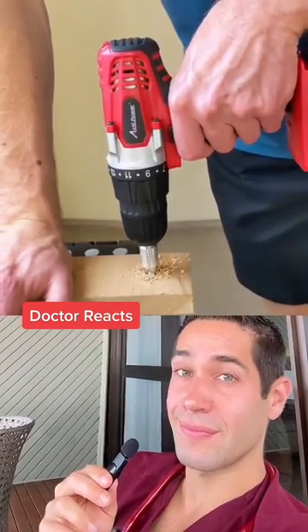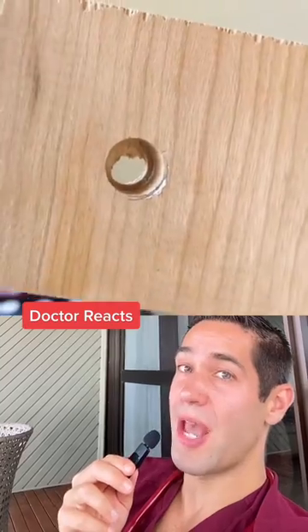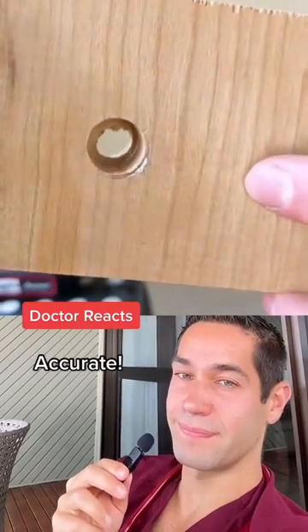So even though this is on a piece of wood, the drill bit still stops right as it breaks through. And there you have it — that is how the surgeon avoids drilling right into your brain during brain surgery.